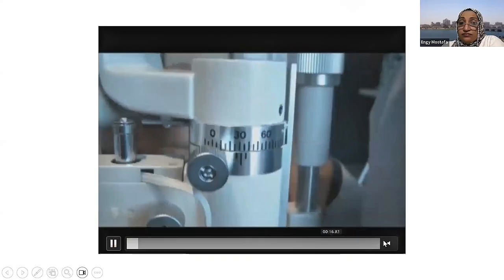So when do we decouple the light and the viewing system? We decouple it in the sclerotic examination. When do we use a monocular viewing system? Like in applanation tonometer and in specular examination. I hope this was helpful. Happy to receive any questions. Thank you.